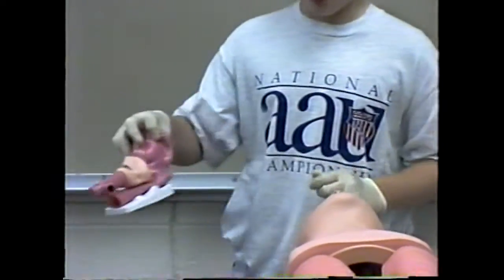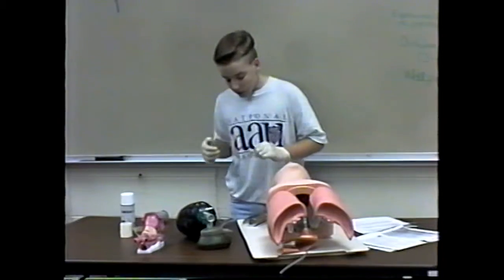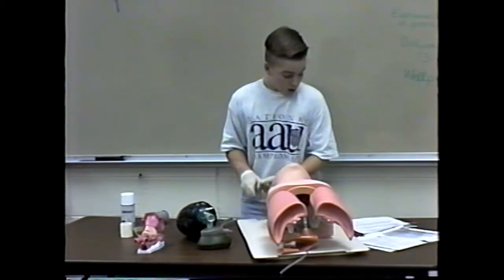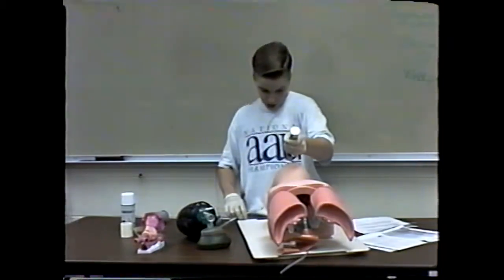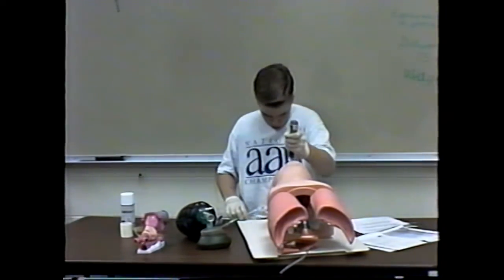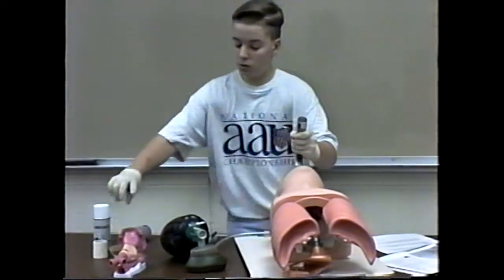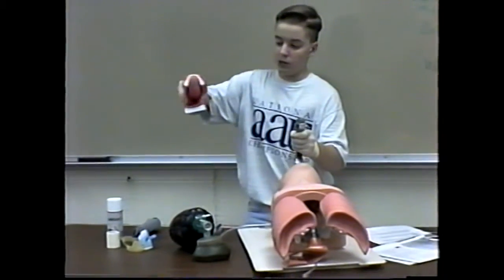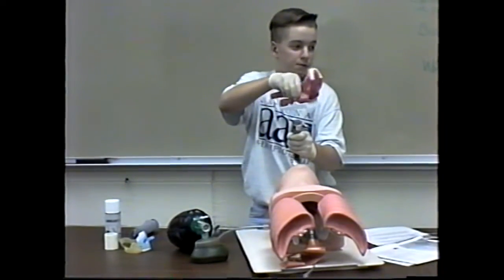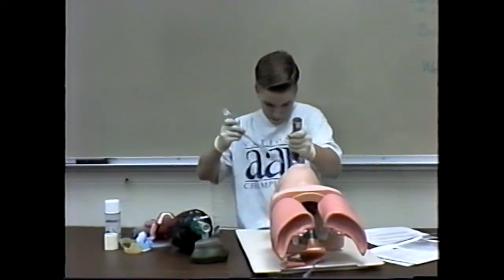That's what closes when you drink water, so it doesn't go down your stomach, or so it doesn't go down your lungs. You insert the laryngoscope to the right side of the mouth until you find the epiglottis. And then when you lift, you see the vocal cords, which are the round pieces of skin under your epiglottis. And then you lift that up.